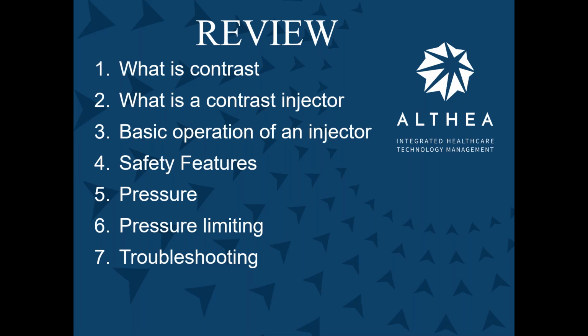Pressure, we know what pressure is, right? Do 1200 PSI go into the patient's arm? Why do we need 1200 PSI? To maintain the requested flow rate. So where is the pressure on these injectors? At the patient's arm or inside the injector?